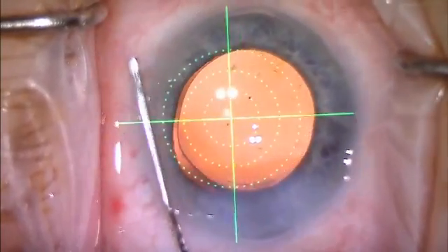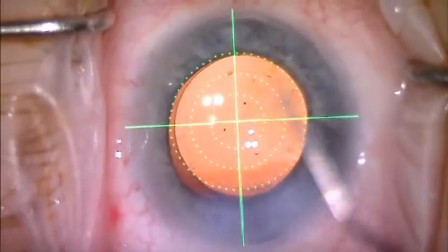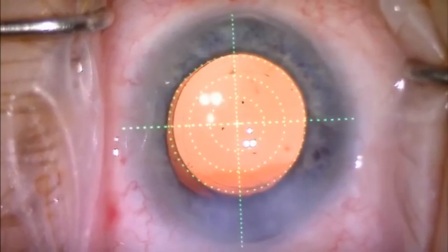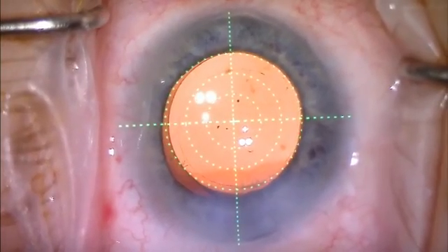So there we are. That's our end product with a perfect capsulotomy and an intraocular lens that is centered on the preoperative pupil.